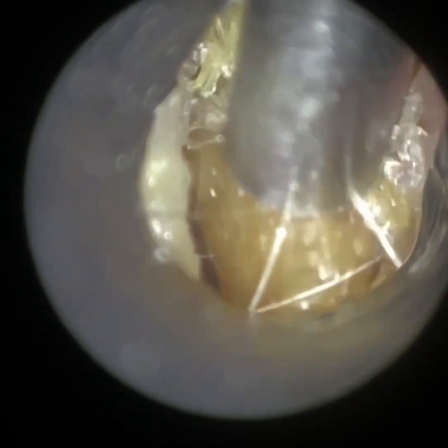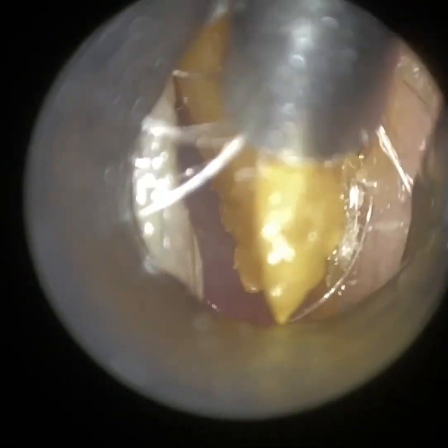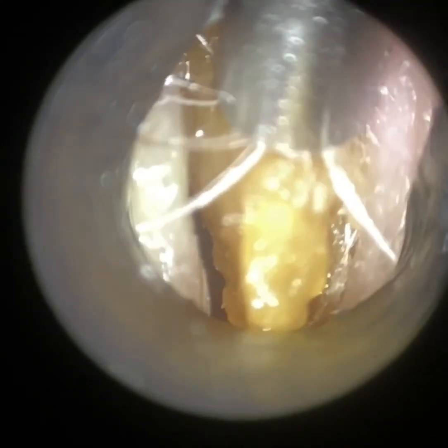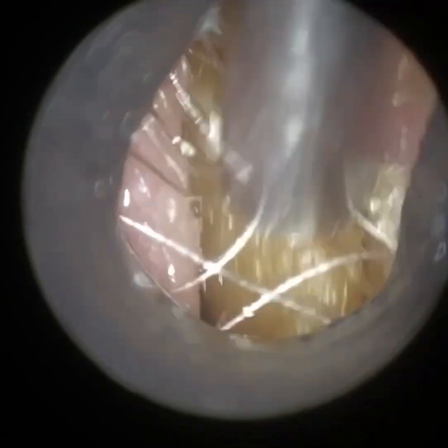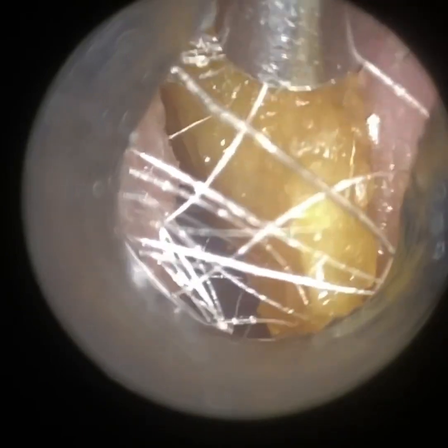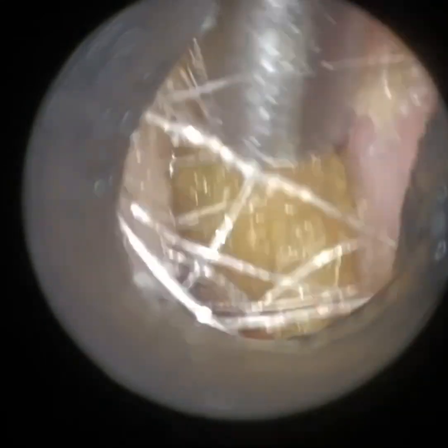You can see just how narrow this patient's ear canal is. This is probably around a centimetre into the ear canal, and the suction probe just about enters now. The speculum — we could push it in a bit further, but then we'll be making contact with the wax. By pushing the speculum further, we probably wouldn't be able to stretch this ear any further because the narrowing is not typically at the entrance; it's a bit further in.